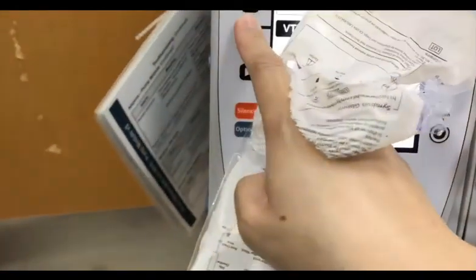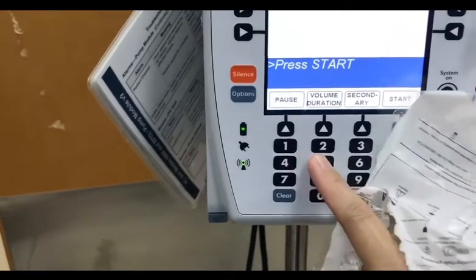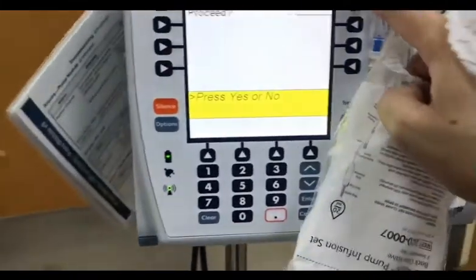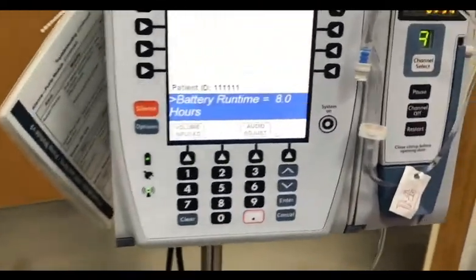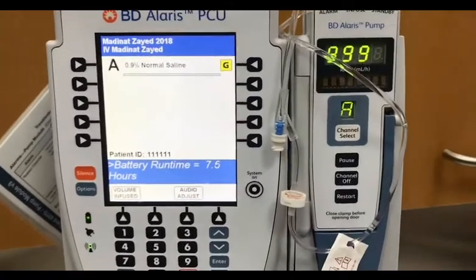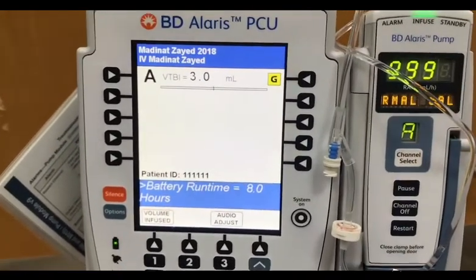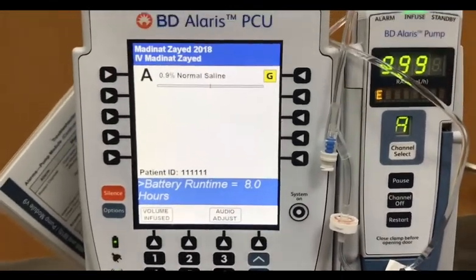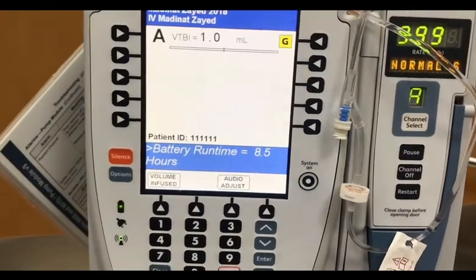And let's say only 5 ml, so that it will alarm right away. So we will wait and let us listen how it alarms when it reaches the 5 ml or the 5 cc. So at this time, you can go out.